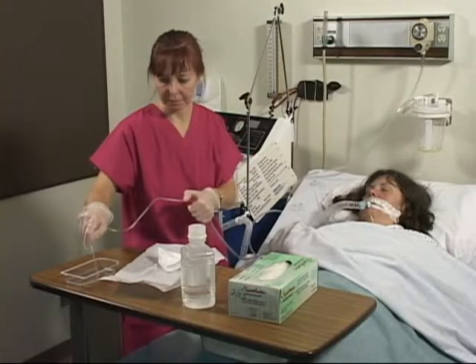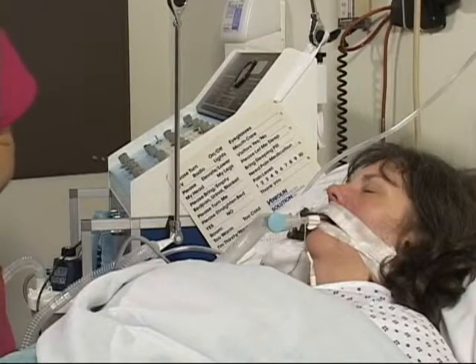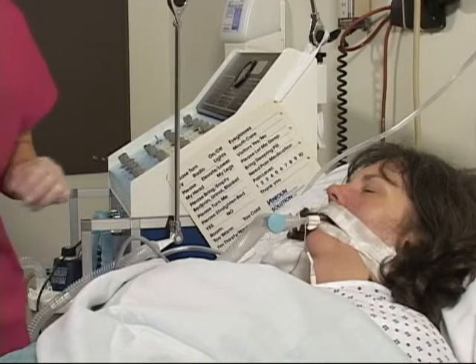If repeat suctioning is required, then repeat the pre-oxygenate steps as before. A second person will be required to do this manually so as not to break sterility. Rinse the catheter by dipping into sterile water between suction passes. When finished with the endotracheal suction, the rinsed catheter can then be used to suction the client's mouth before and after oral hygiene. Having an endotracheal tube can be uncomfortable.